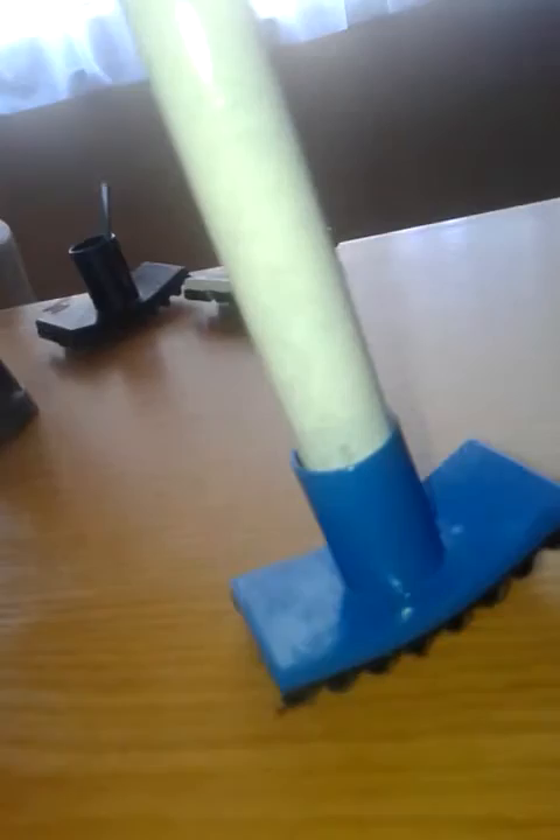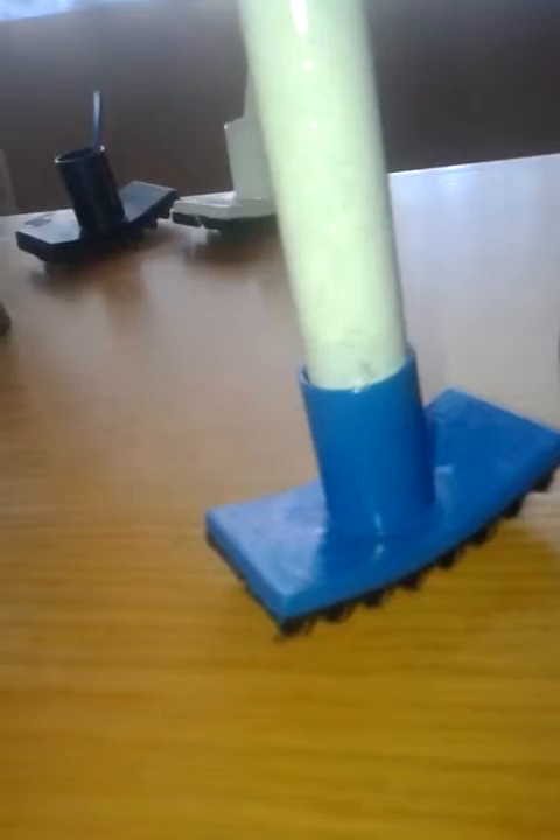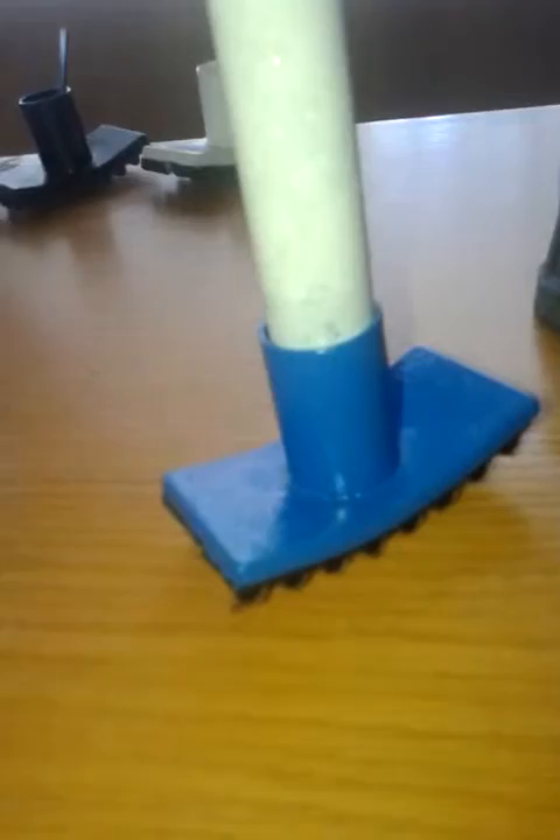It's the first-ever solution for crutch rubbers. Hospitals, clinics, everyone who needs it is going to have to order this. Back in 2013 there were already 650 million people with permanent disabilities, so there is a big market for this product.